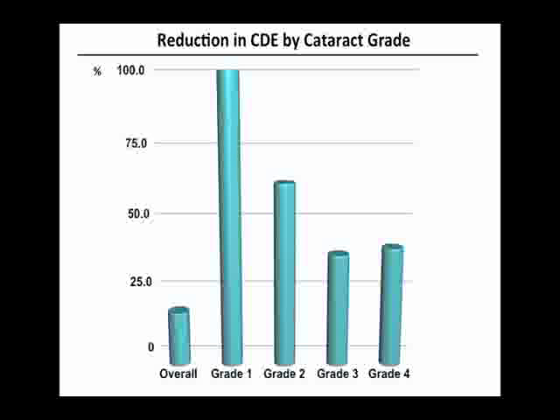For grades three and four, the percentage reduction in CDE is less, but the absolute reduction in ultrasound energy is much more significant.